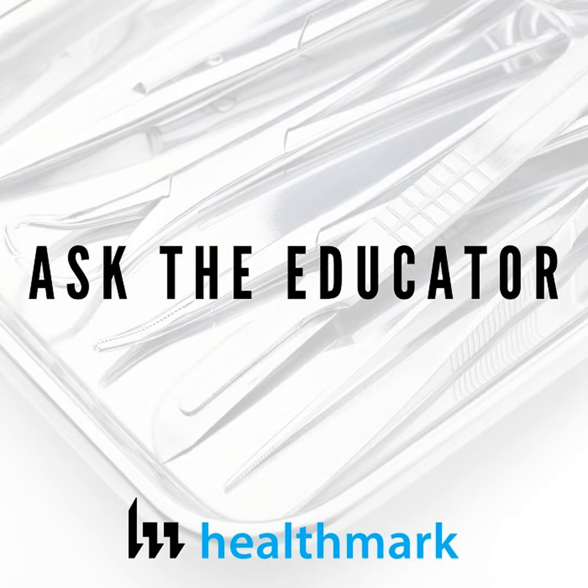And so when you start going down the list, as well as touching sterile tissue or touching an intervening sterile device, in those two points, it's very clear from federal guidance that if it touches anything sterile, it needs to be sterile. We all understand that. If it touches the sterile needle and it's not sterile, then that needle is not sterile, and federal guidance says it needs to be sterile. Why? Because you're directly touching sterile tissue. And then also you're touching the wound directly. It's a small wound. It's not a large wound, but it's still a wound. It's a pathway. And when pathogens are microns in size, a needle puncture is a highway for them to get in. So it's a matter of perspective.